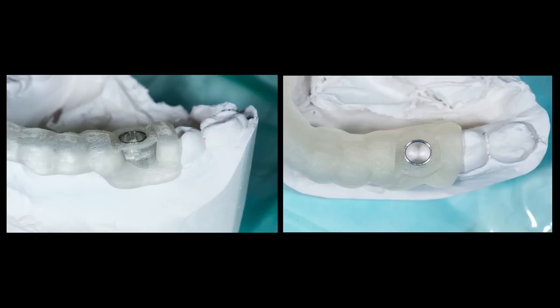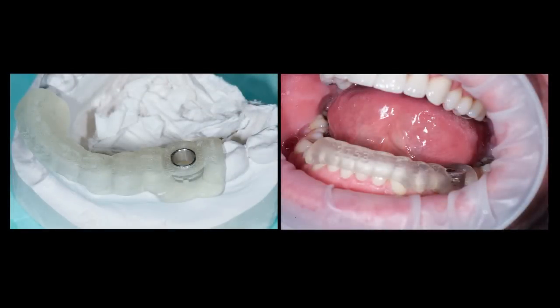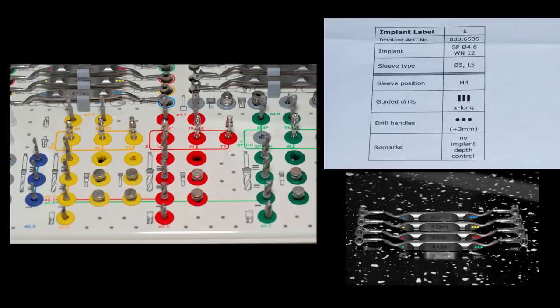Here's another view of the surgical guide and here's the surgical guide in the patient's mouth. We did the surgery with an Ivoclar Optragate in place — I find that's a very nice retractor and I can see very easily. I filmed the surgery with my Zeiss microscope. Here's the protocol for this particular case: I'm going to be using extra long guided drills and the plus-three drill handle. This is going to be a lot of instrumentation to fit in the patient's mouth for a 3.6 location, so the only challenge is whether I have enough mouth opening space. It says no implant depth control, which applies only to the profile drill because you can't profile-drill a wide neck implant through a 5.0mm collar. I get complete depth control with the guided drills.